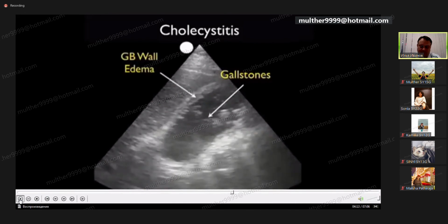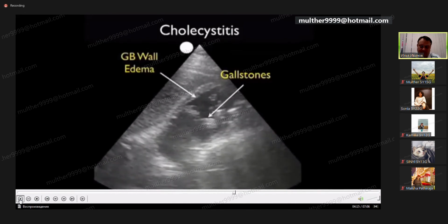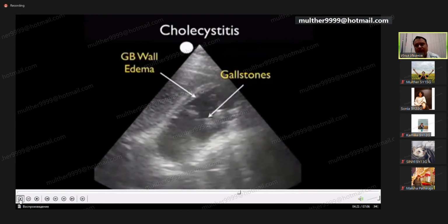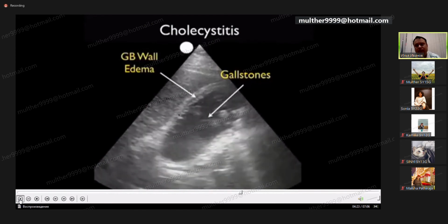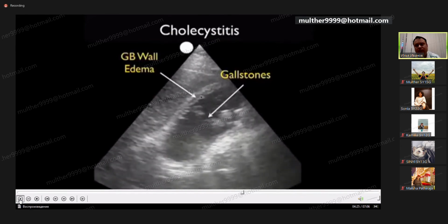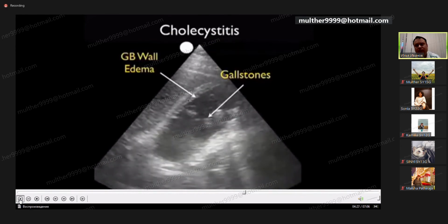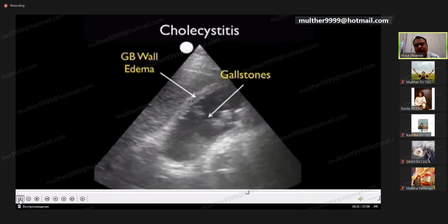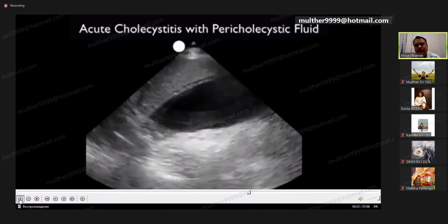Anterior gallbladder wall, and within the wall of the gallbladder we see a stripe of black fluid consistent with gallbladder wall edema. And here with the small indicator arrow, I'm just going to trace out that area of gallbladder wall edema within that anterior wall of the gallbladder. Interestingly enough, at surgery, the gallbladder was found to be very edematous, inflamed, and the wall was necrotic.